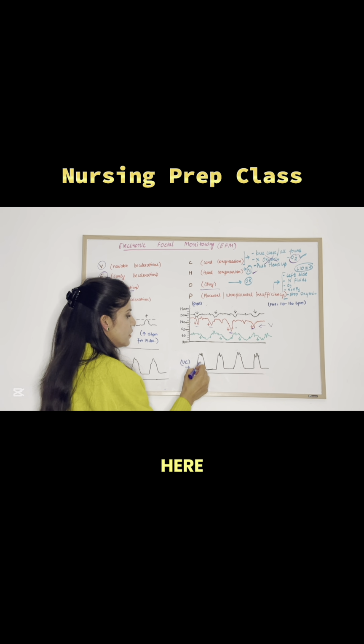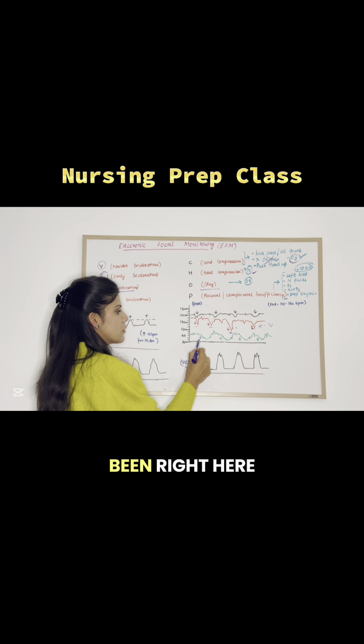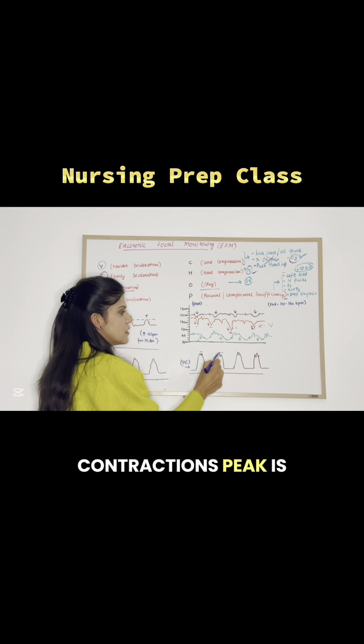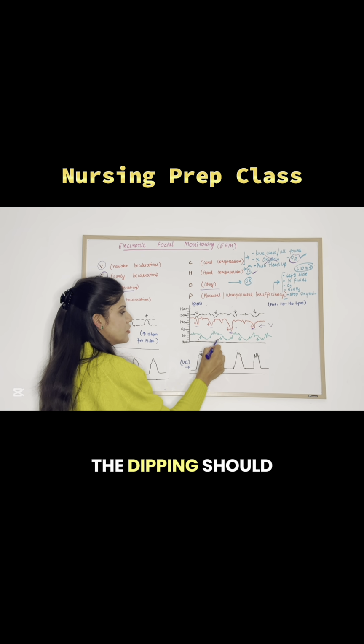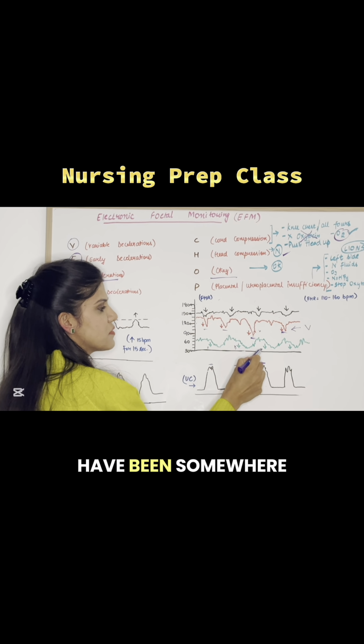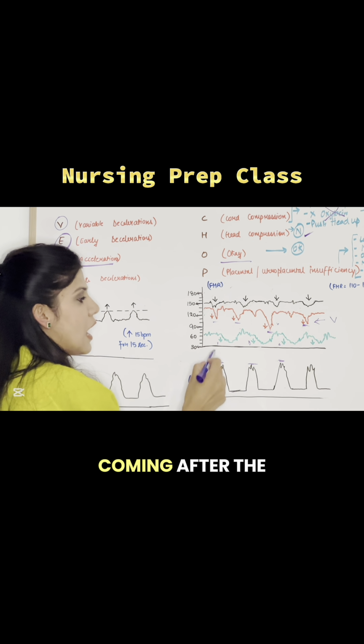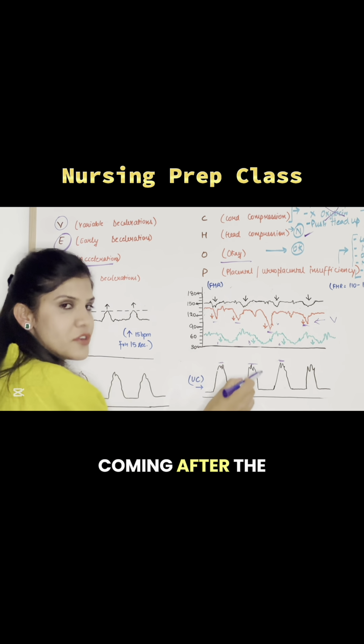Now let us take a look here. So the uterine contraction is peaking right here. It should have been right here. Contraction's peak is right here. The dipping should have been somewhere right here. Contraction was right here. The dipping should have been somewhere right here. But what is happening? The dipping is coming after the uterine contractions, means they are late.